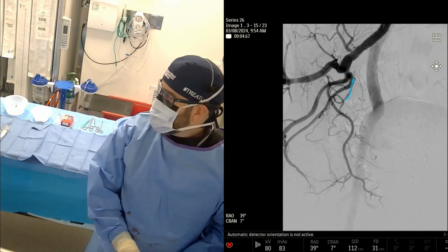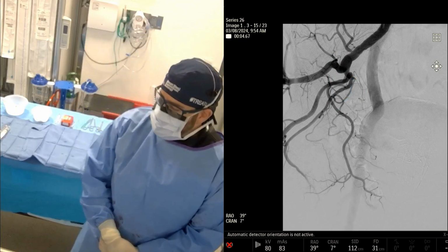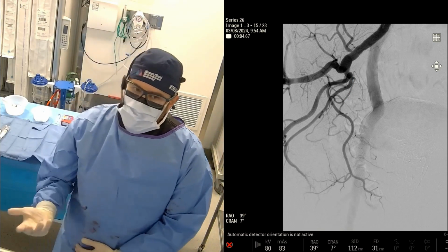What was the other side? Was it pudendal or gluteal? I think it was gluteal. It was a 5. I have to go back and look. It was a 5, it was gluteal. The 1 is going to be the shared origin.